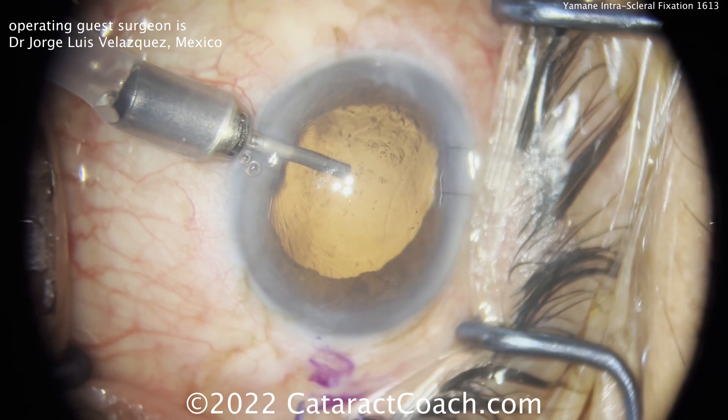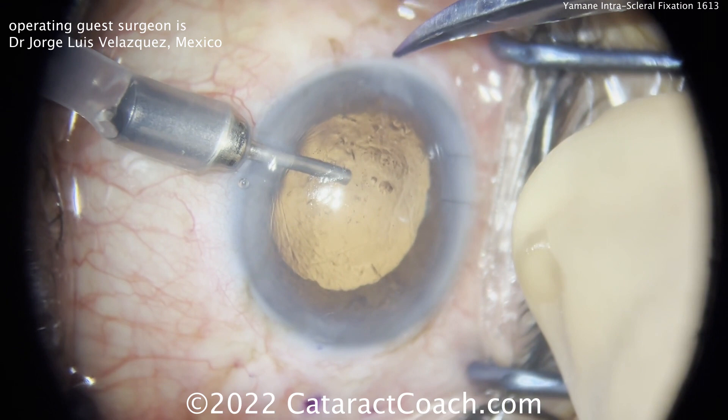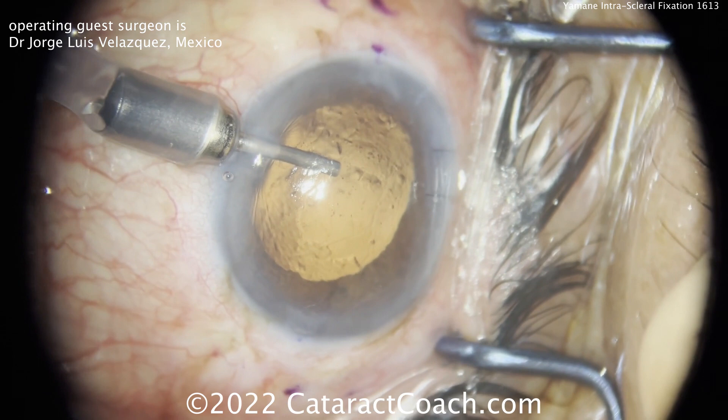Starting off here with an anterior chamber maintainer, and now marking the conjunctiva appropriately — about two millimeters posterior to the limbus, with marks about two millimeters apart. That AC maintainer is going to help keep the eye inflated, especially because it looks like a unique eye that has probably already had a vitrectomy. We can see a couple of sutures on the right side of the cornea at the limbal junction.